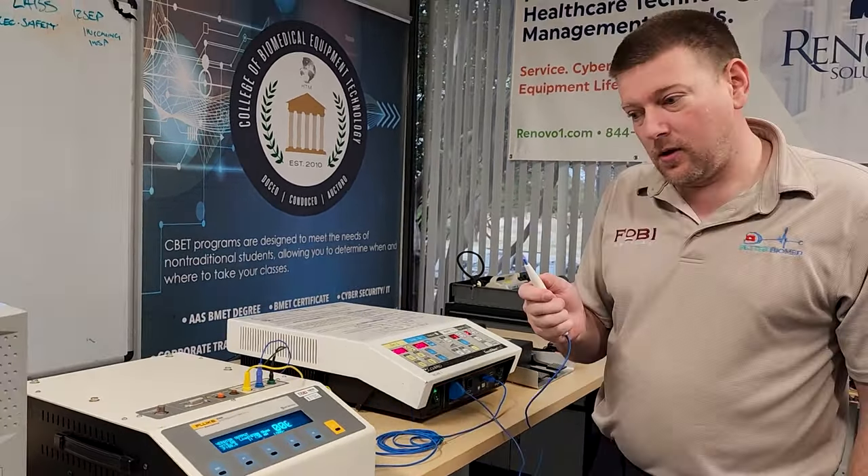Taking the load down to 200 ohms on the closed electrode and running it at 300 cut, 120 coag, and 50 watts bipolar. Result: nothing. We have nothing on the patient return — that's a good thing.